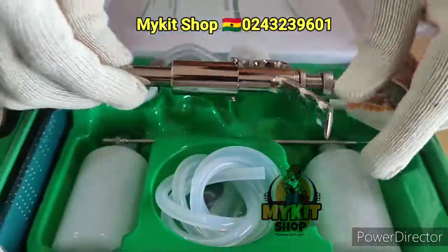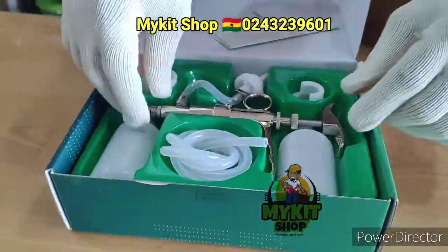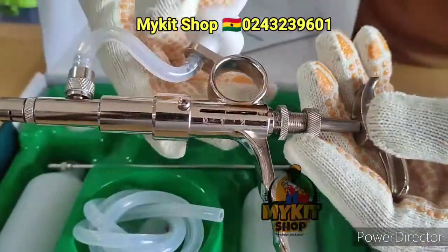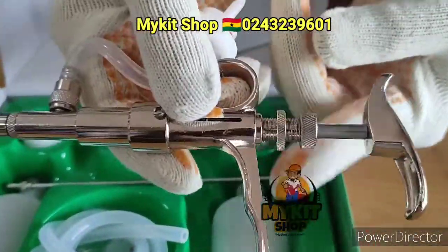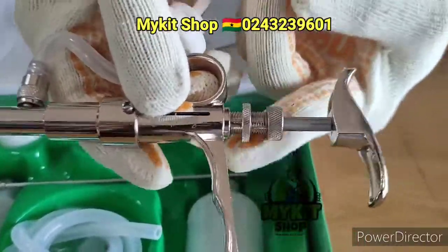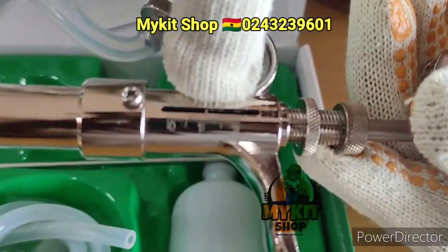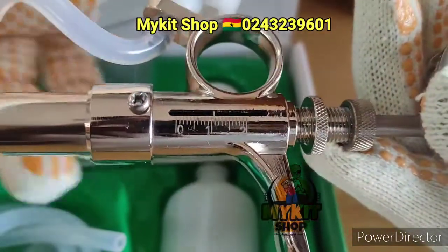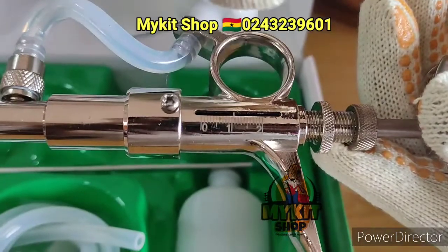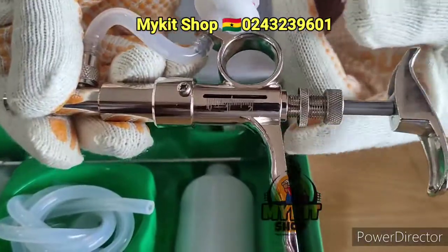I'm going to show you how to adjust it to the ml you want. Over here we have this screw that you can move around — let's call it a locker. Then we have the pointer right here, which is currently at about 1ml. For example, I want to do Newcastle vaccination and adjust it to 0.5ml.